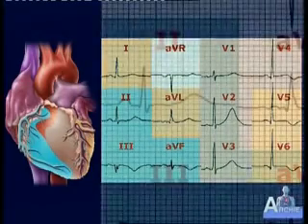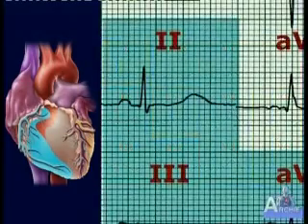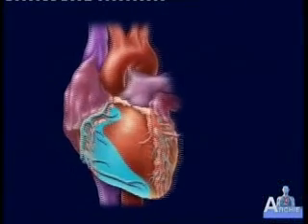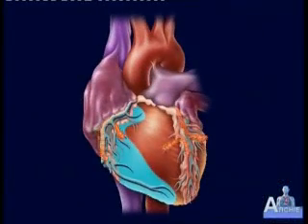This is a close-up view of a simulated QRS complex and T-wave. Note the relatively flat ST segment and the upright T-wave. Both are normal and indicative of normal conduction.